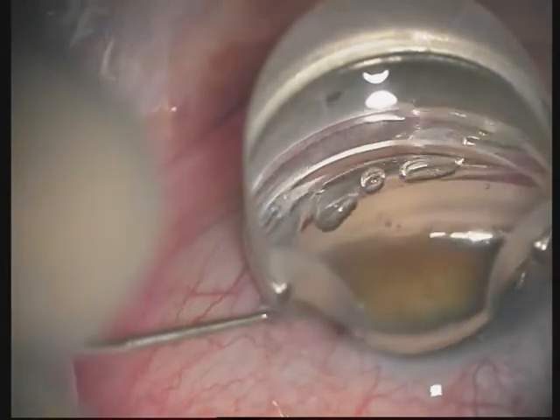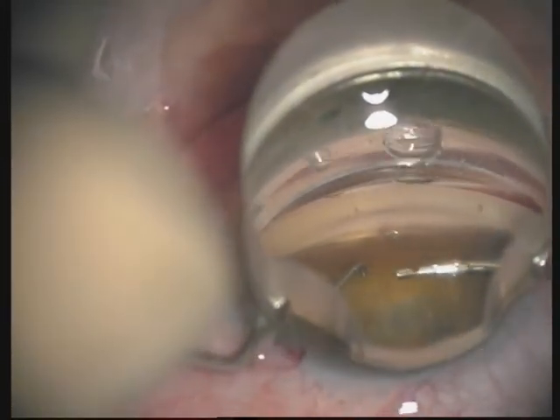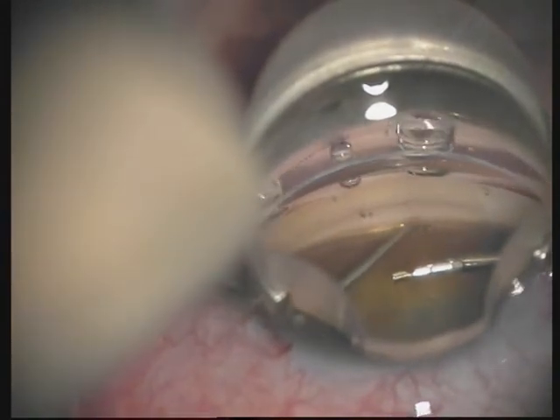If the surgeon is using a second instrument in the non-dominant hand to stabilize the eye during surgery, this instrument could be used for intraocular manipulations as well.